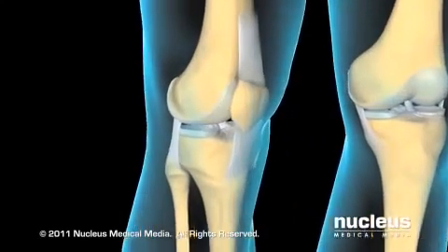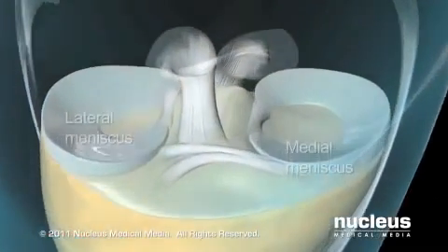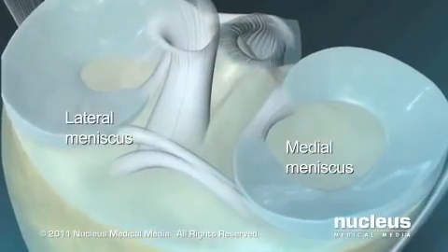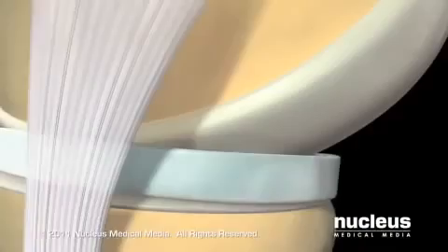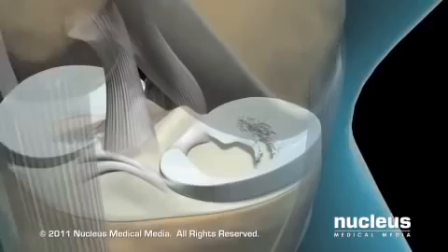Knee arthroscopy is used in the diagnosis and treatment of a number of knee disorders and injuries. One common use is in the treatment of meniscal tears. Under normal conditions, the menisci — C-shaped pieces of cartilage resting between the femur and the tibia — provide cushioning and stability for your knee joint.